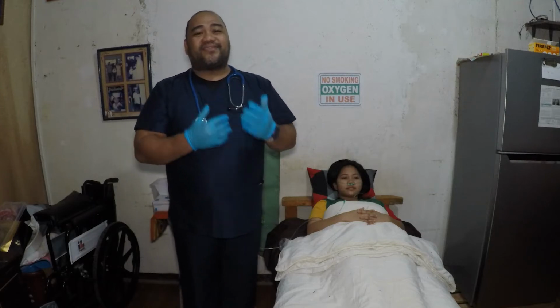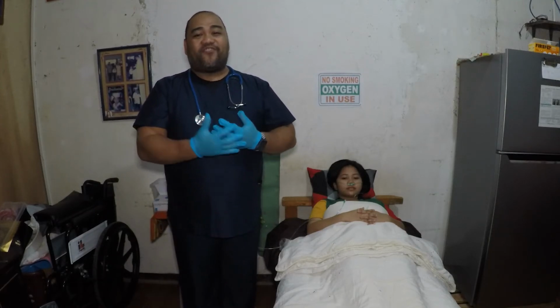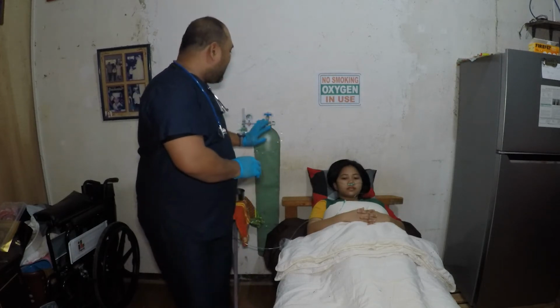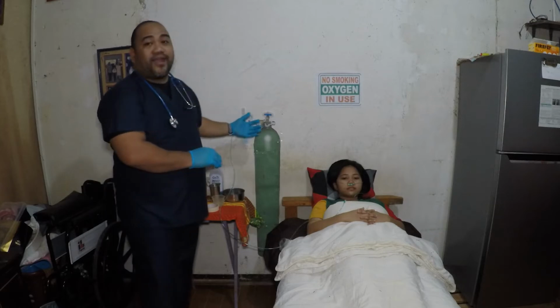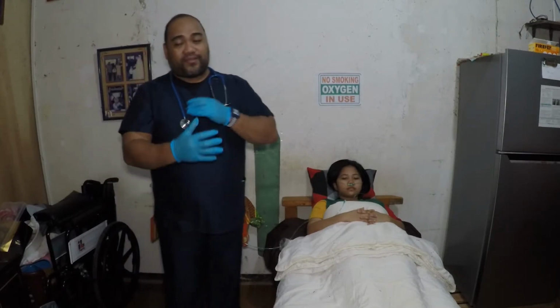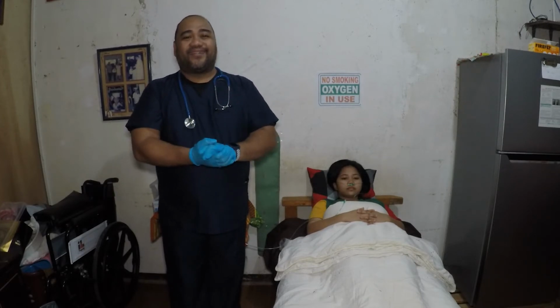So this is to initiate the oxygen flow, to maintain the doctor's prescription and avoid oxygen toxicity. Just make sure that the actual record or the actual request by the doctor is followed properly so that we could save the clients from any danger. These are the procedures in administering oxygen inhalation or oxygen administration.